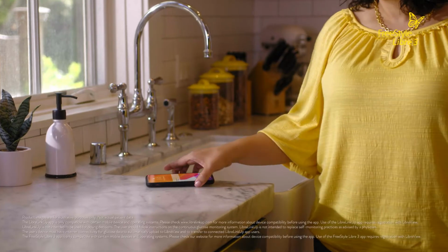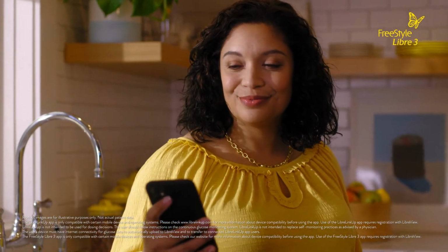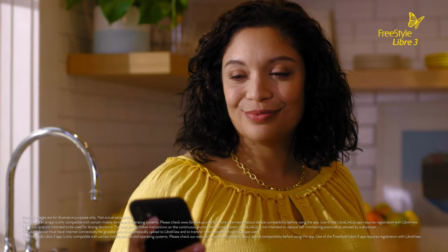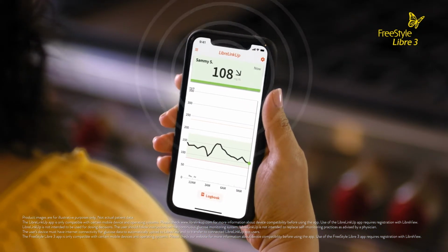I like using the LibreLinkUp app, so I can be in the know too. Whether she's at school, playing sports, or sleeping, I can monitor her glucose wherever I am, because her glucose readings are sent directly to my smartphone every single minute.